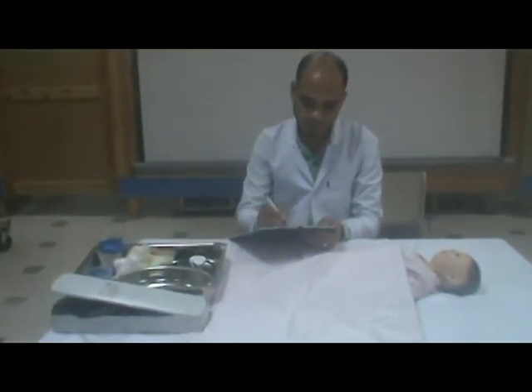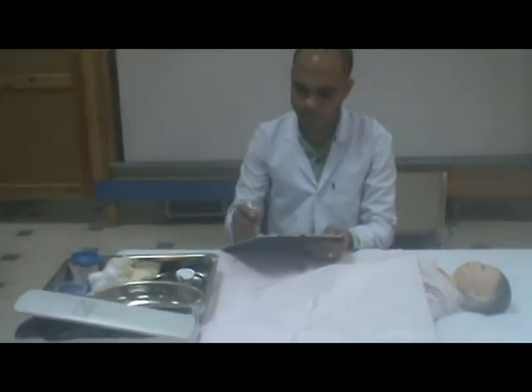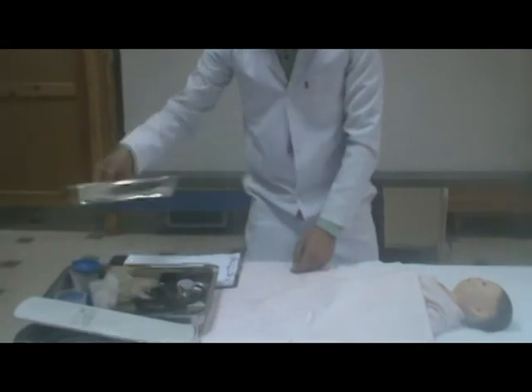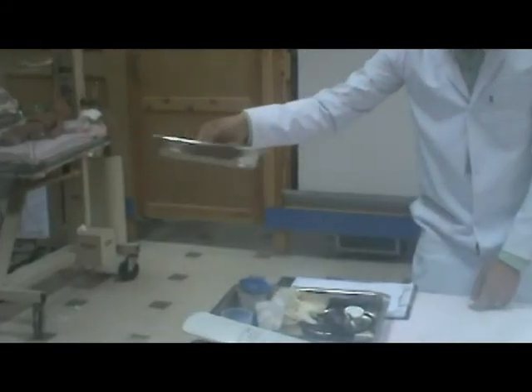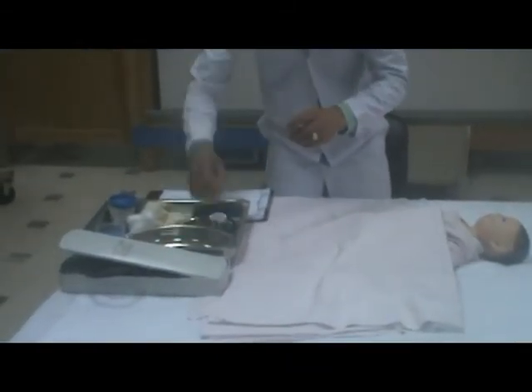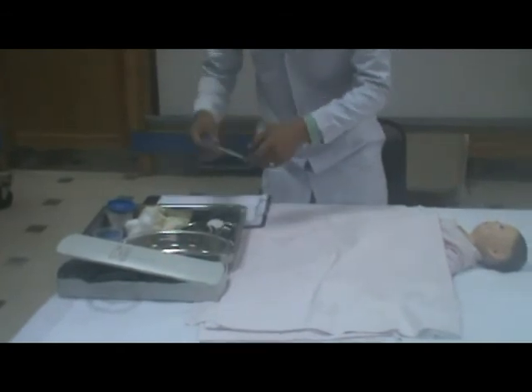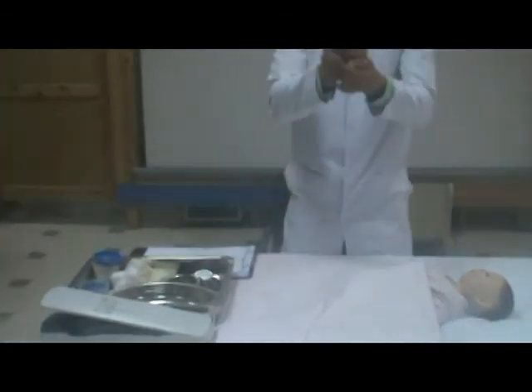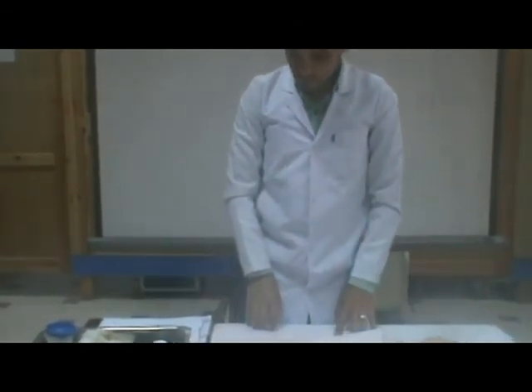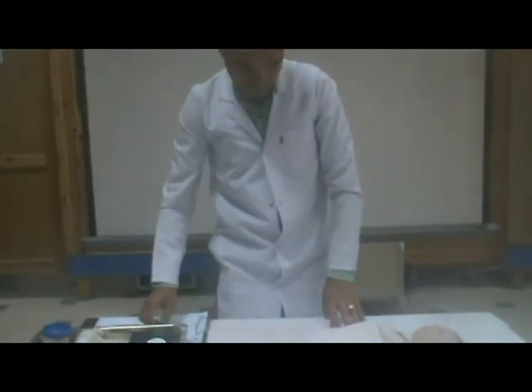Number 10, clean the thermometer with soap and tap water. Number 11, dry it and keep it in its container. Number 12, wash hands to reduce transmission of infection. Number 13, thank the child for cooperation.